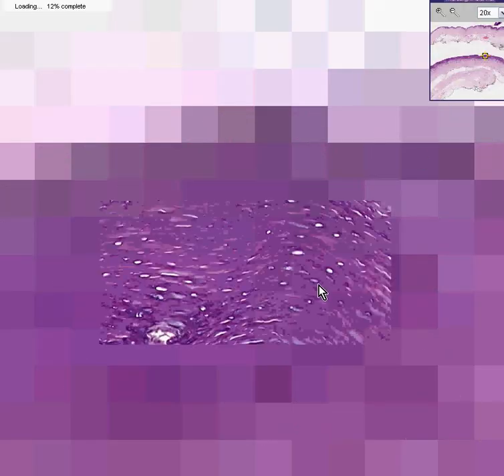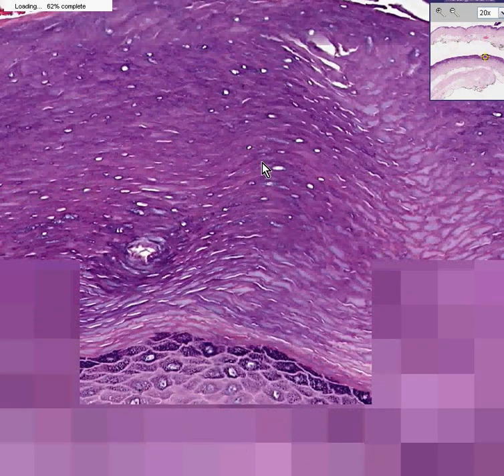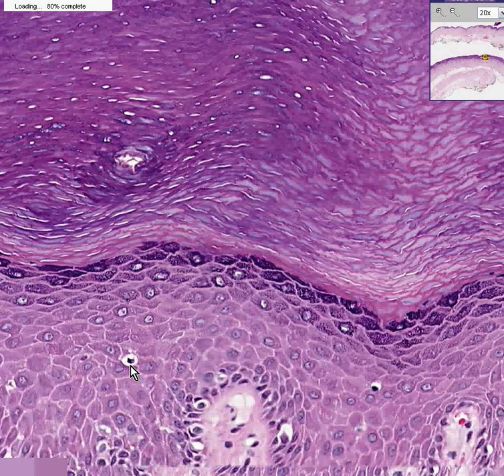And atypia itself within melanocytes is not good. It may be a precursor to malignant melanoma. But look, even more upsetting is the fact that there is genuine buckshotting here. Here's a melanocyte well within the spinous layer, the acanthotic layer, the stratum spinosum. So even though it's not atypical, it is definitely well within the middle of the epidermis. This is a very, very significant sign. And if you were to see a lot of this, you could definitely diagnose melanoma in situ.